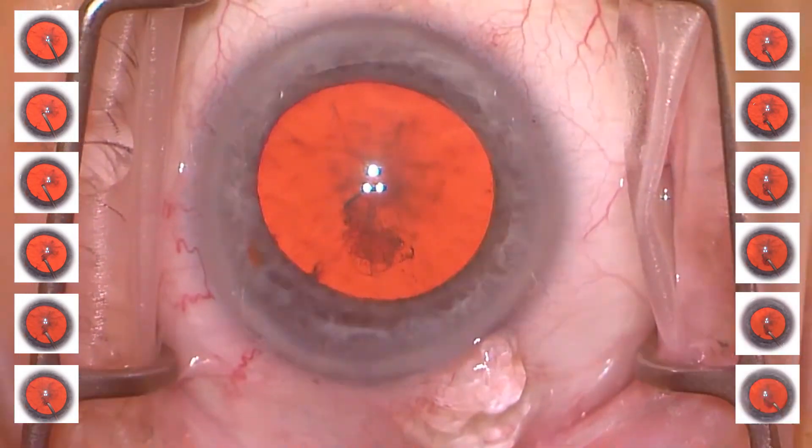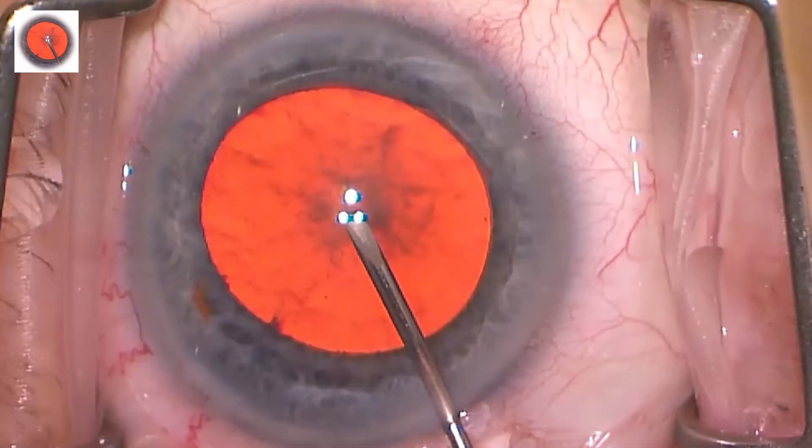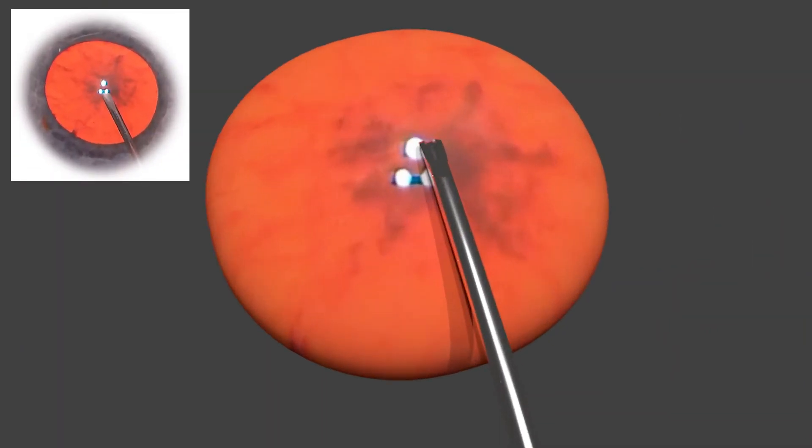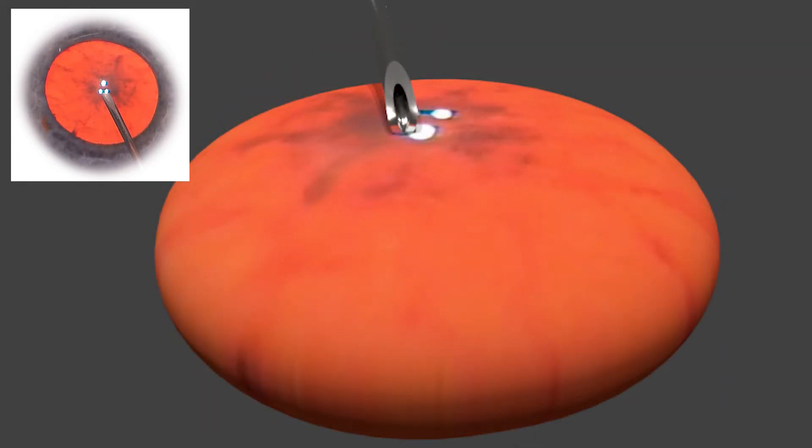I will use some 3D modeling to point out how this rhexis could have been more effective. Let's look at our first 3D view, which is pretty much as one would see from looking down through the microscope. I've removed all the eye except for what would represent the lens. This next view is one that you never really get to see, and teachers have to verbally explain — but I think it can be very instructional to look almost on face, or opposite the cystotome, as it does what it needs to do.